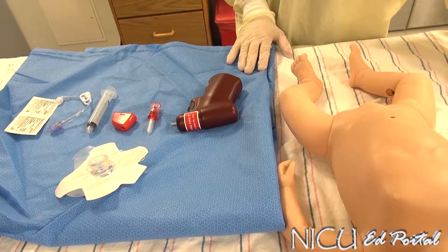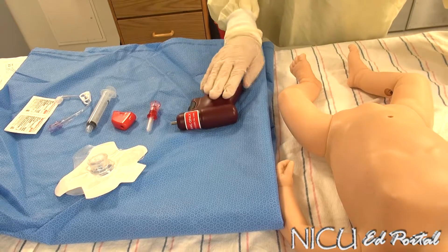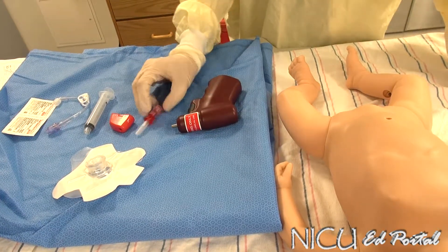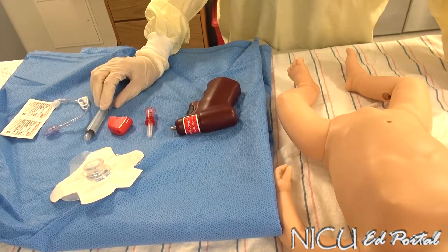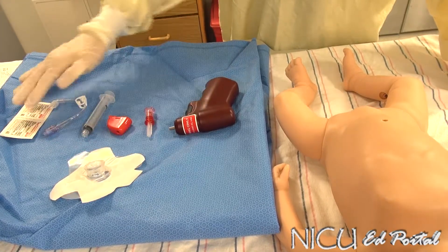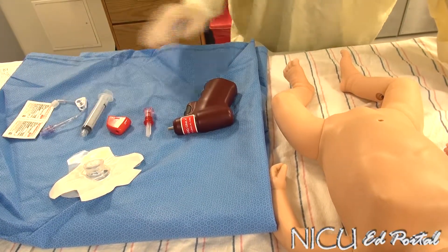The equipment that we need for this is an IO drill, the IO needle, as well as your syringe, your stabilizer, your cleaning supplies, and then your connector.